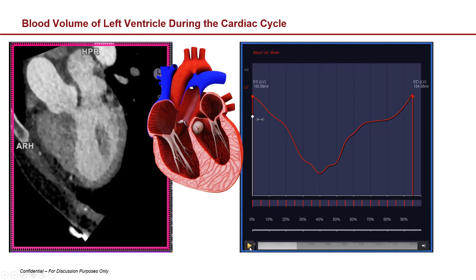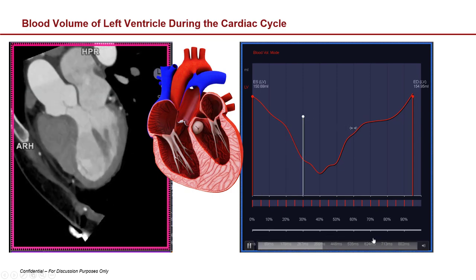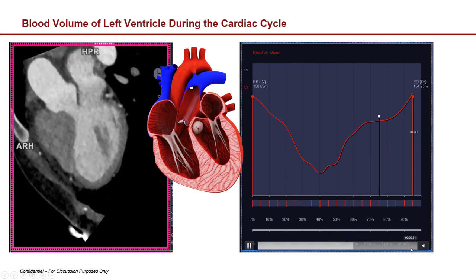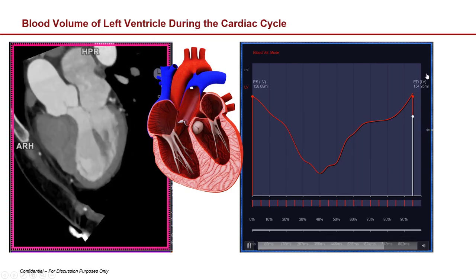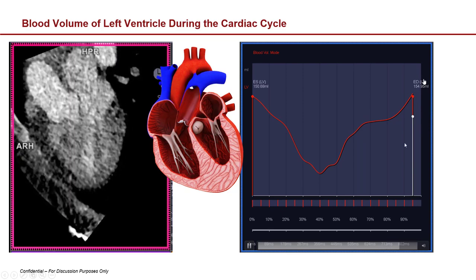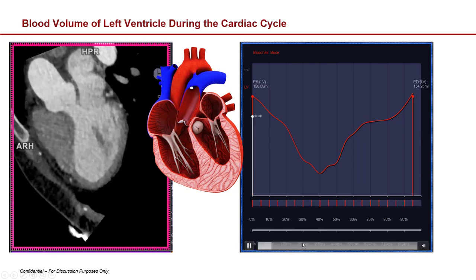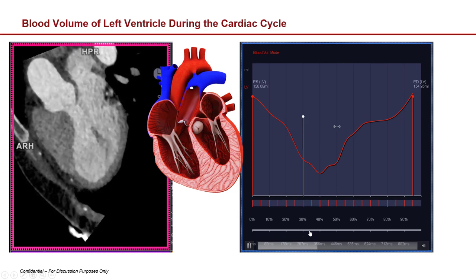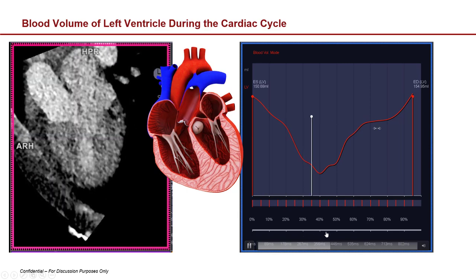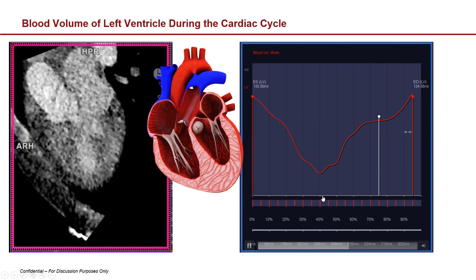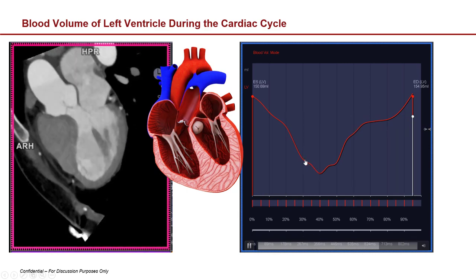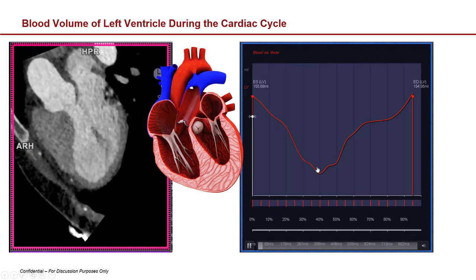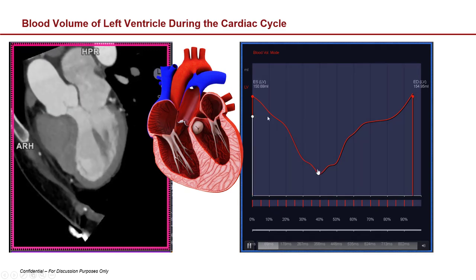Down here you can see these millisecond values. 802 milliseconds is the length of the heartbeat; 89 milliseconds, or roughly between 260 and 350 milliseconds, is a really good place to look for images that aren't moving.